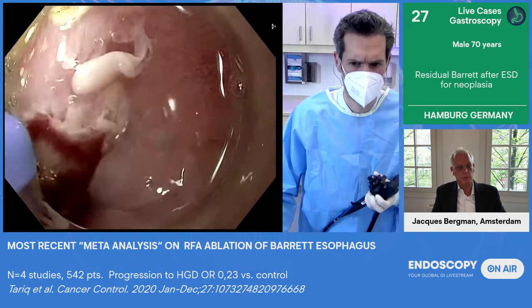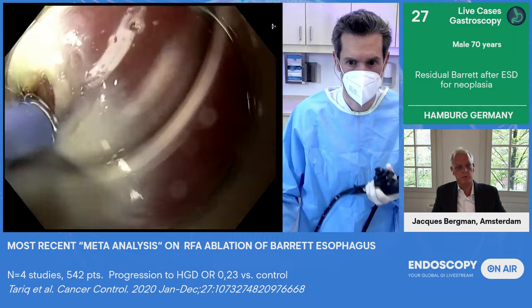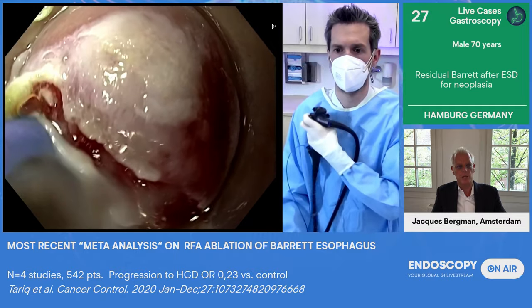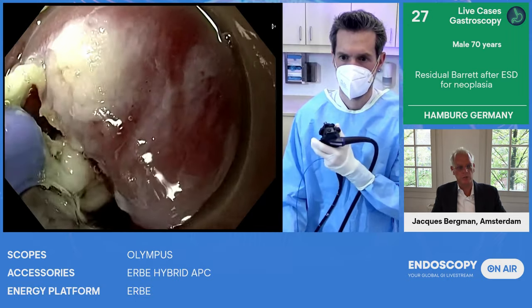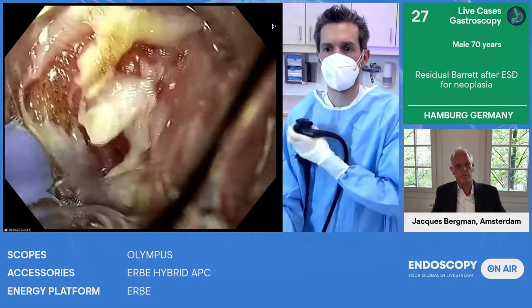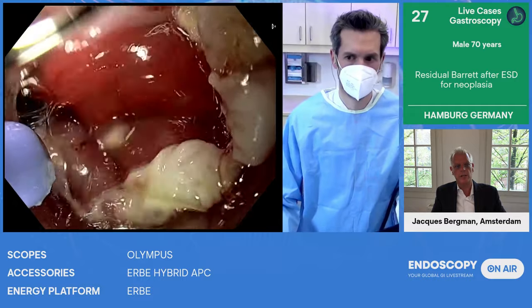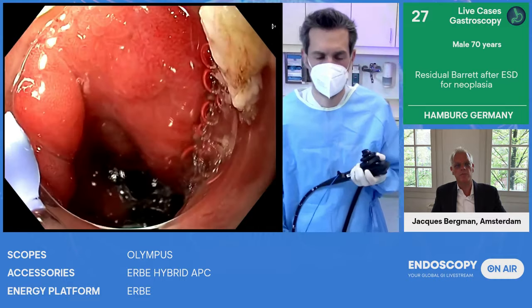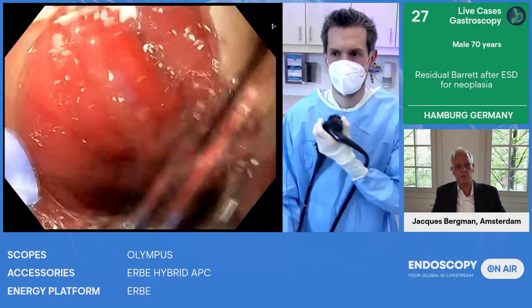While you may continue using the APC, I think it's very important that you use the cap because it allows you to get in between the fold and to stabilize yourself. Contact technique and not being in contact is easier with the cap. So that's a crucial thing. True. The second thing is you have to be careful that by cleaning, you will slough off also the squamous mucosa. And a sloughed off area of ablated squamous mucosa just looks like a Barrett's tongue. So you run the risk that you keep on ablating, and every time that you clean, it still looks like Barrett's, but it's not Barrett's, it's squamous. So that's a pitfall for less experienced endoscopists using this.